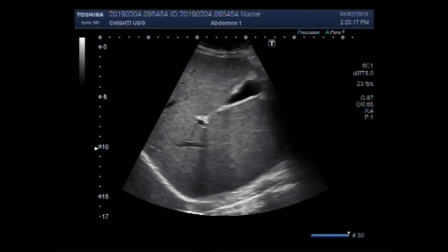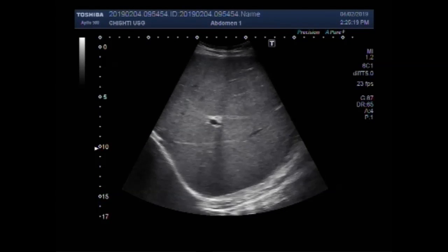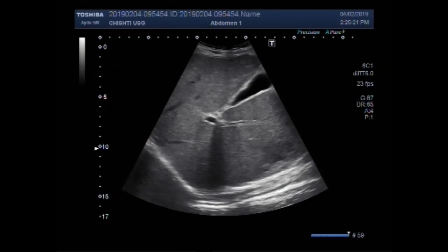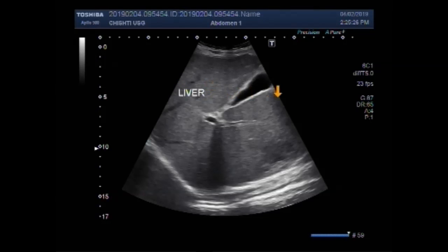Dear viewers, I hope you are all fine. This ultrasound video shows a patient having intestinal obstruction with intestinal perforation.